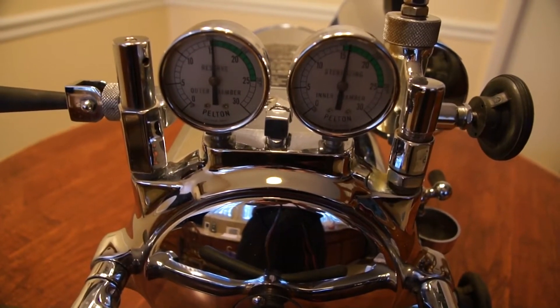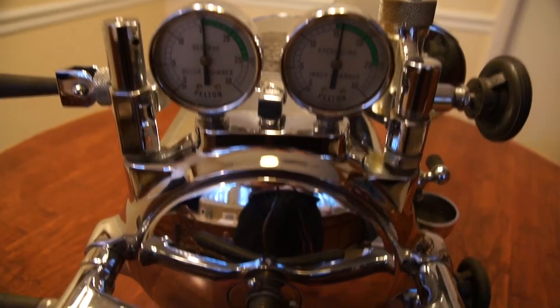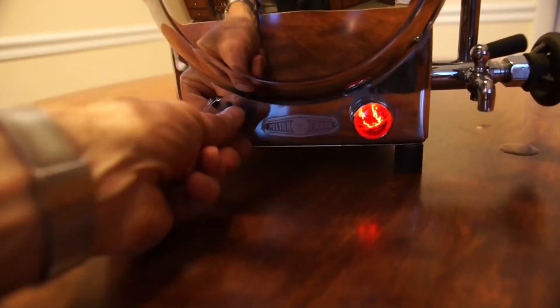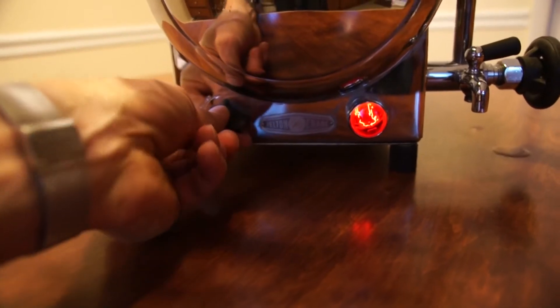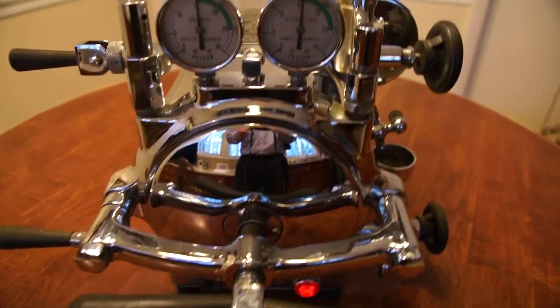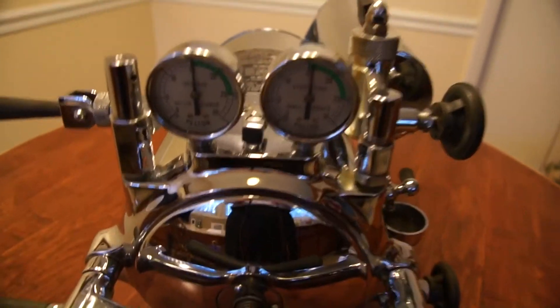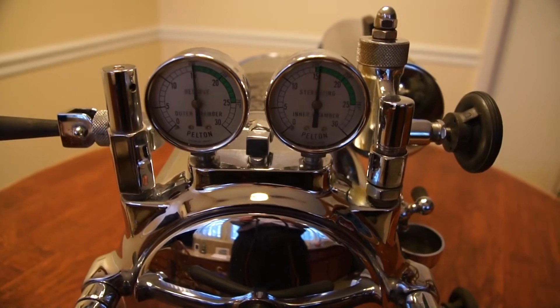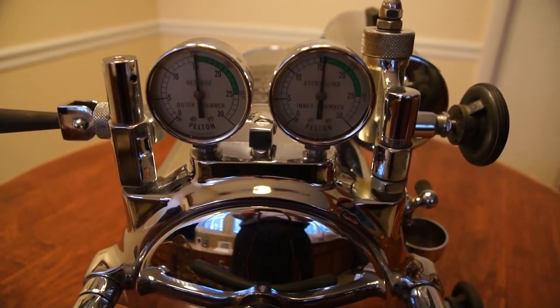We can keep the pressure going up if we like. We can also vary the pressure by this knob down here — decrease up, increase down. We'll begin our timing of sterilization now that we've reached 15 psi on the inner chamber, and to be safe we'll go 30 minutes of sterilization.